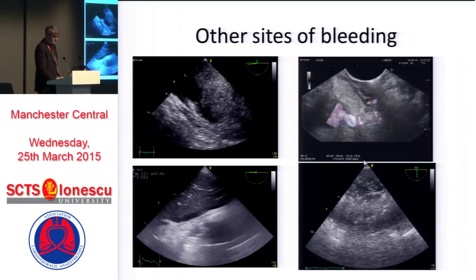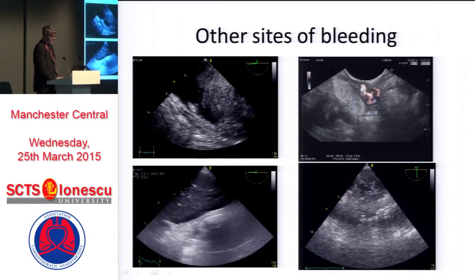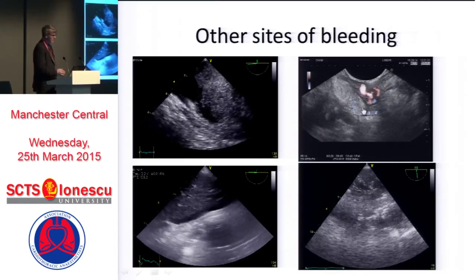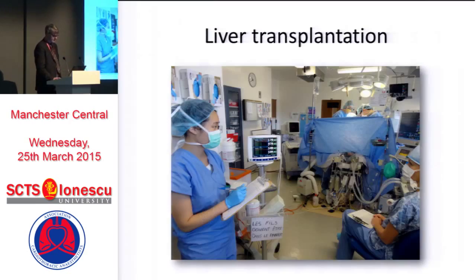And this is something one of my colleagues, who's a gastroenterologist, just sent me. So what you see here are these anechoic areas in the stomach, and basically they are gastric varices. Okay, so that's another reason why someone could be bleeding.